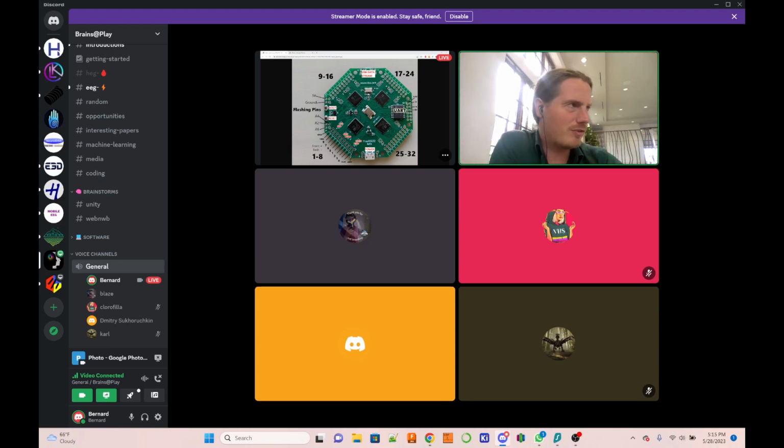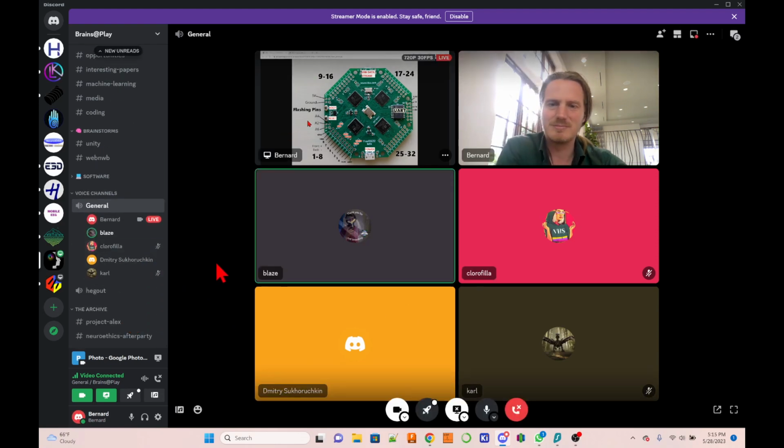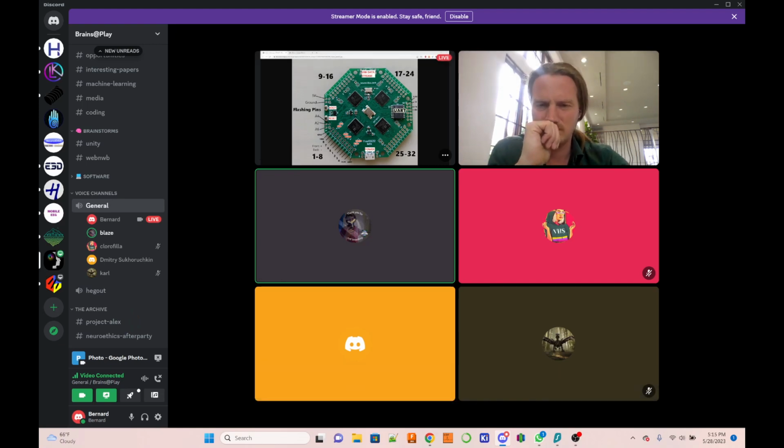But I think instead of copying Cython, you've improved on Cython. So of course things will be different. I think also the typical thing is you use all the bottom ones. So at least what I've seen, you plug in SRB1 as your ground lead in essence, and then you put your signal into the bottom, which are on the negative.